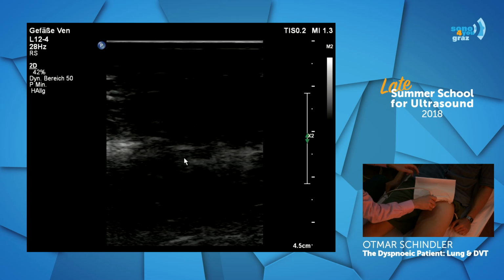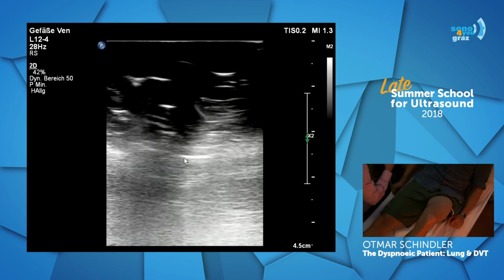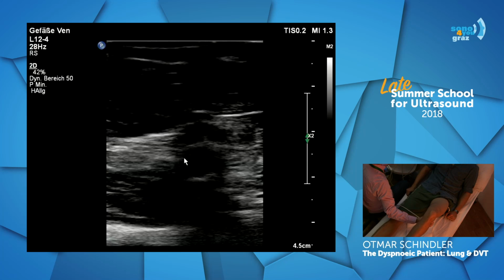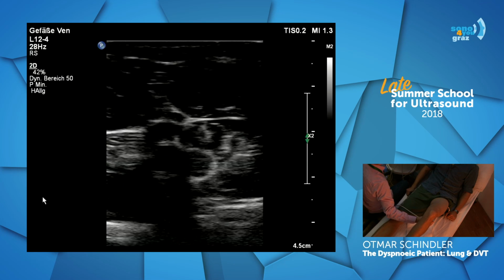If you say I don't have time for that, we just go into the popliteal region.